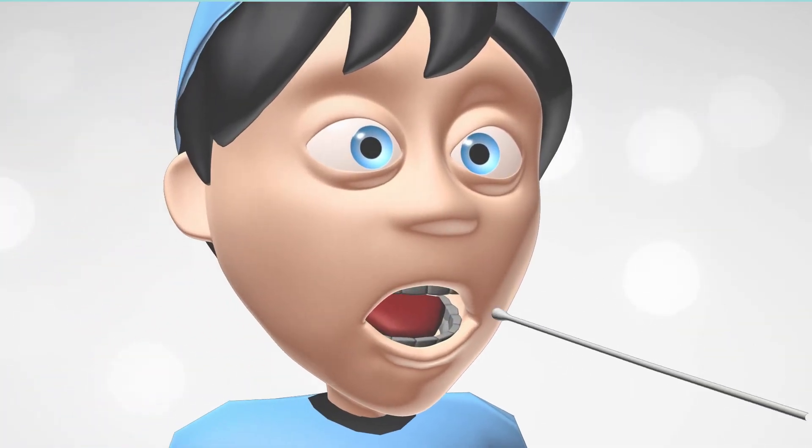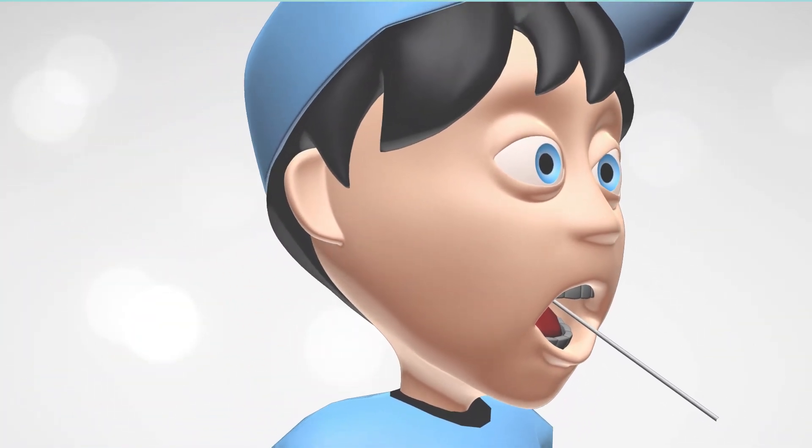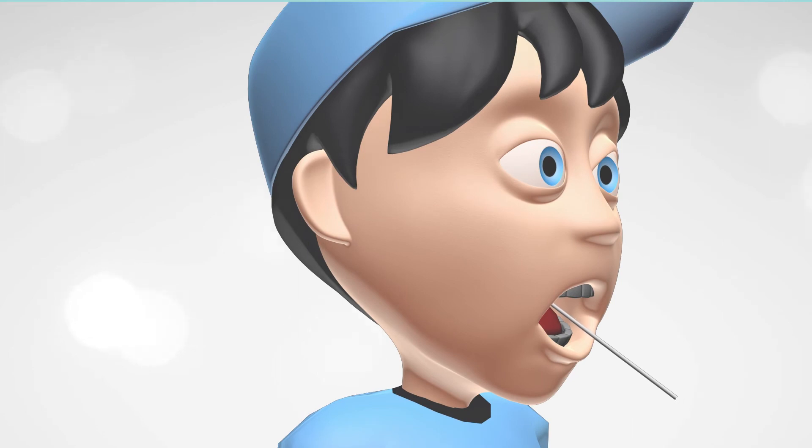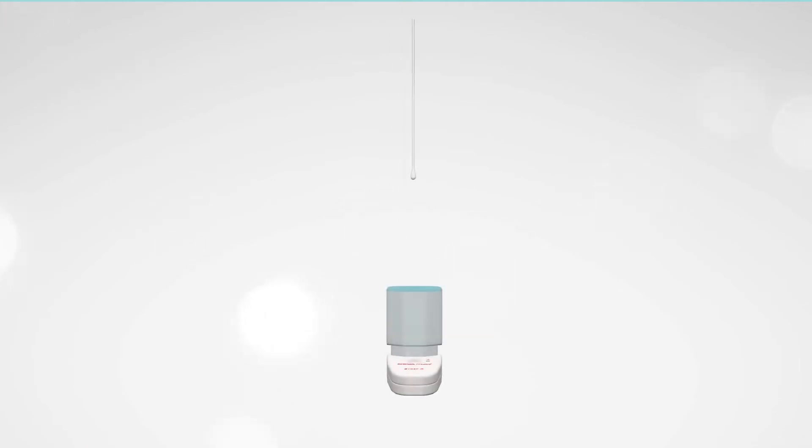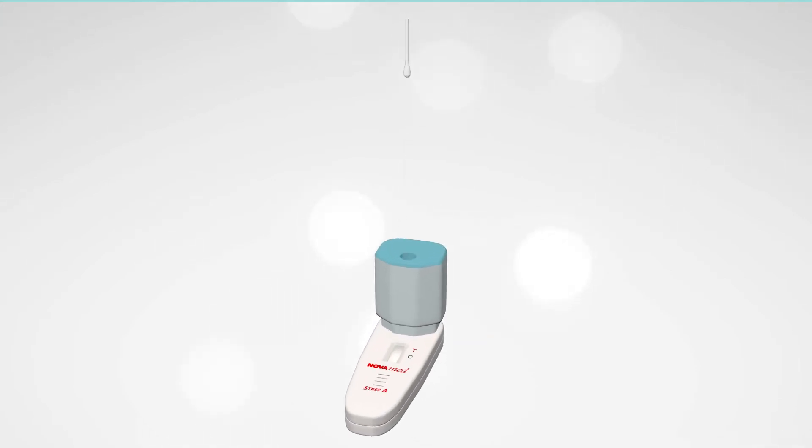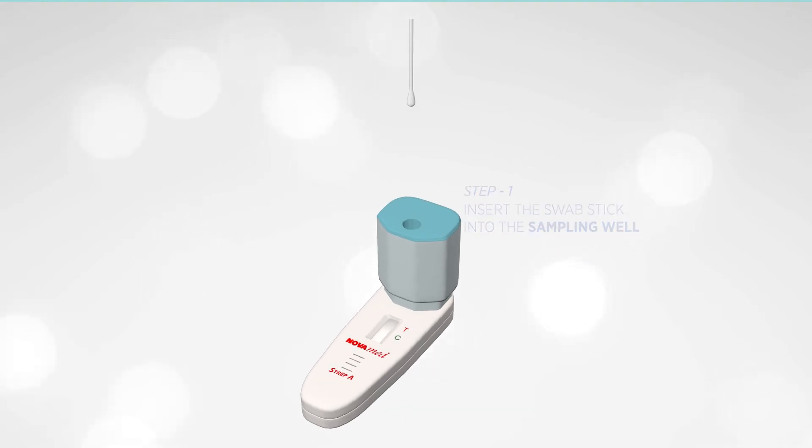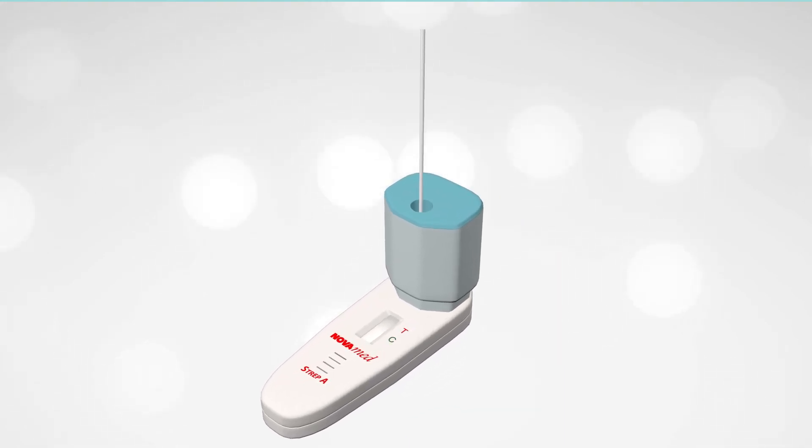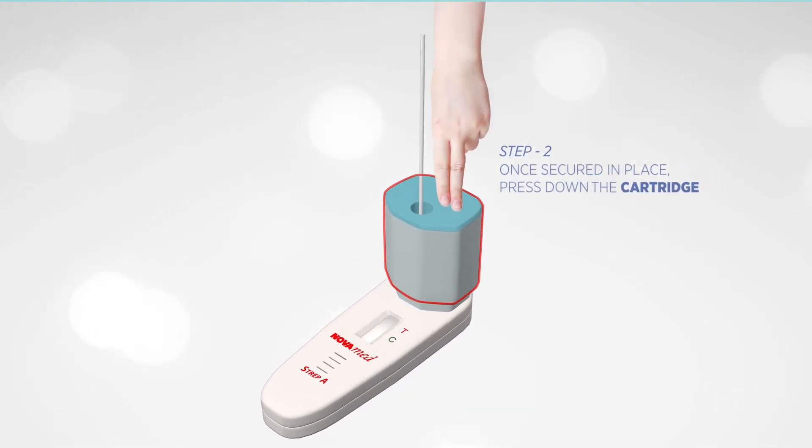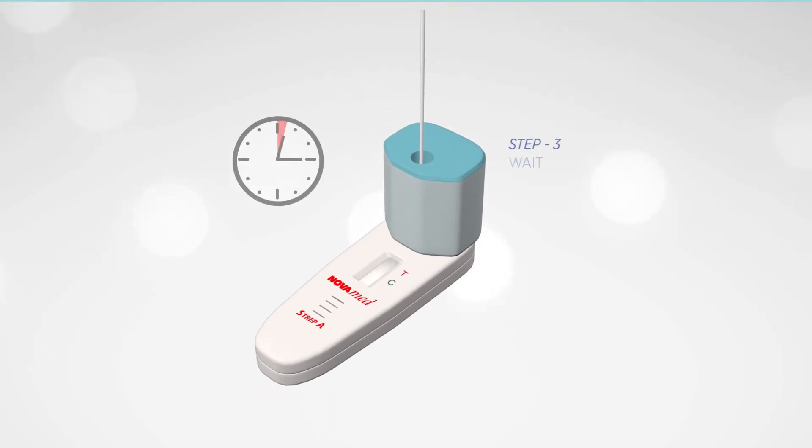Take a throat sample using the swab. Insert it into the sampling well within dark blue area. Press down the cartridge and wait for the results.